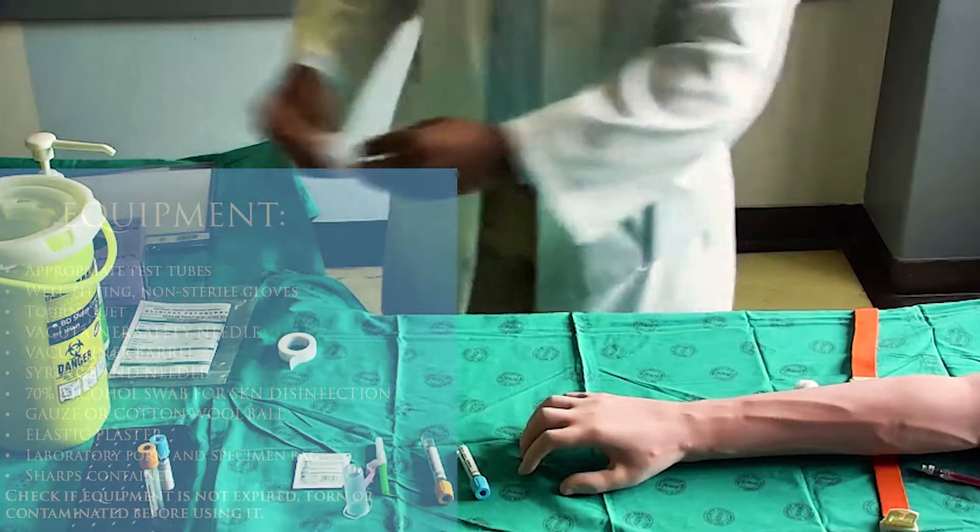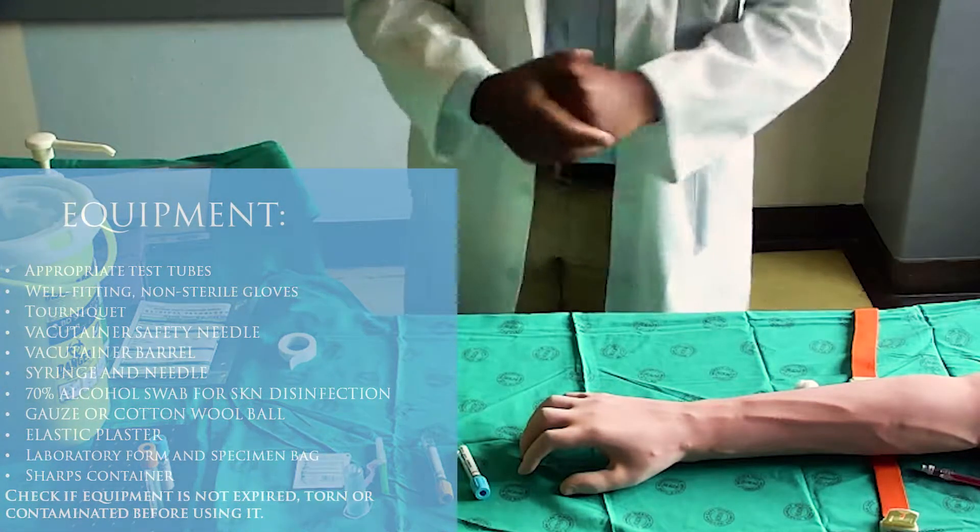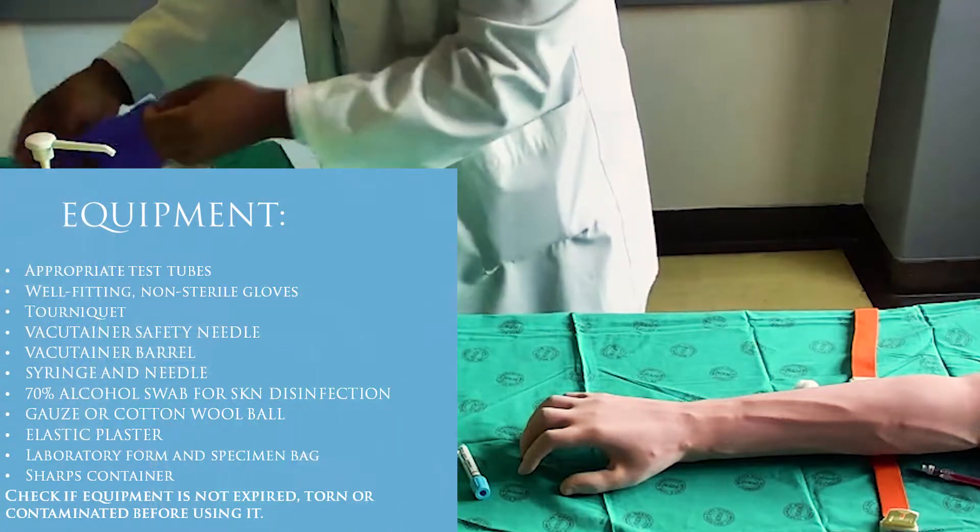Prepare the equipment. Disinfect your hands with disinfectant. Put on non-sterile gloves.